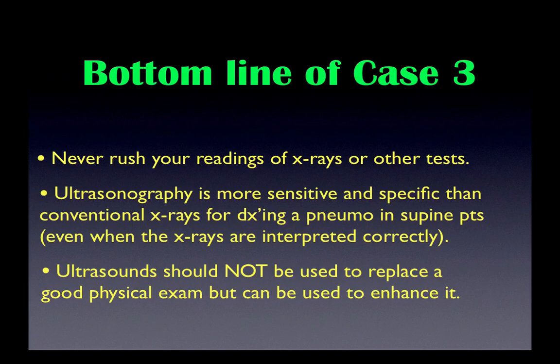And remember, ultrasonography should not be used to replace a good physical exam. It can be used to enhance it. This patient was dehydrated, but it was just difficult to tell clinically.